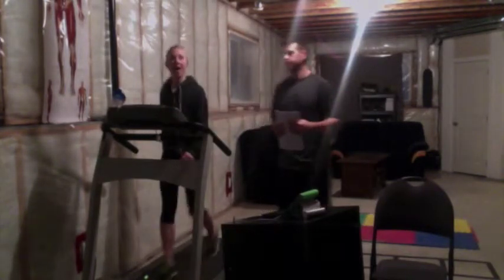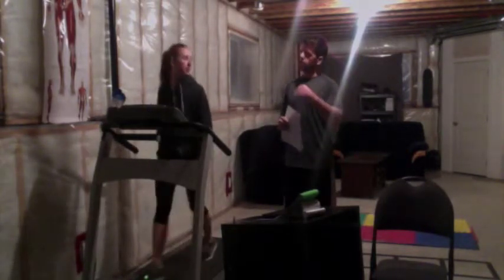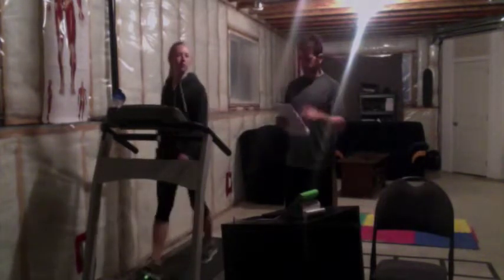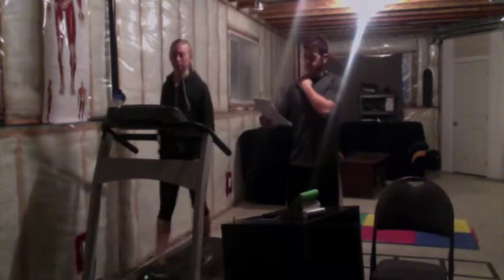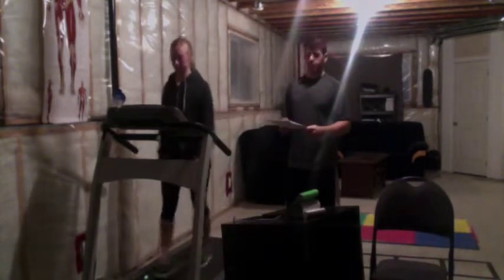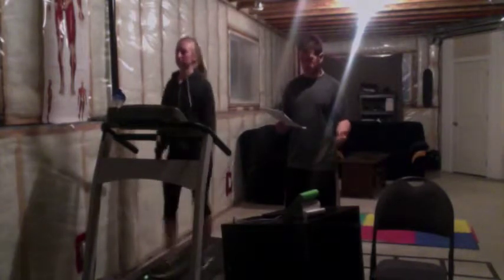To do that, we're just going to increase the speed to about 6.5 miles per hour. And we're going to do that 4 times. We're going to go above for 3 minutes, below for 3 minutes, above, below, 4 times, okay? So basically, with doing this 4 times of above and below anaerobic threshold training, we're gonna overload this anaerobic threshold multiple times.